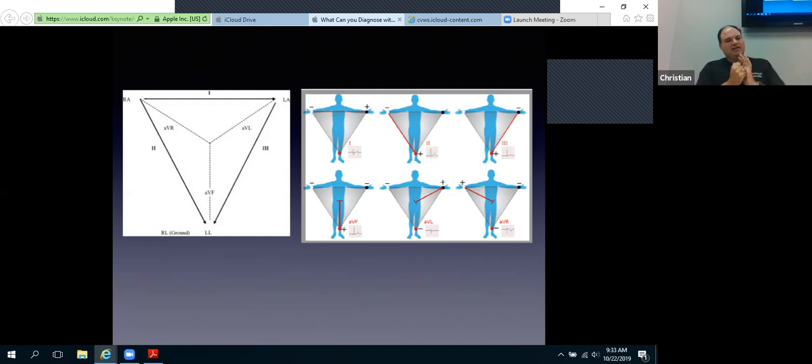And like I said, they're not similar sized ventricles. The right ventricle is considerably thinner than the left ventricle. So in terms of mass and amount of electricity that's generated from the right, it's less than that from the left. And so the majority of the signal should pull towards the left, right?